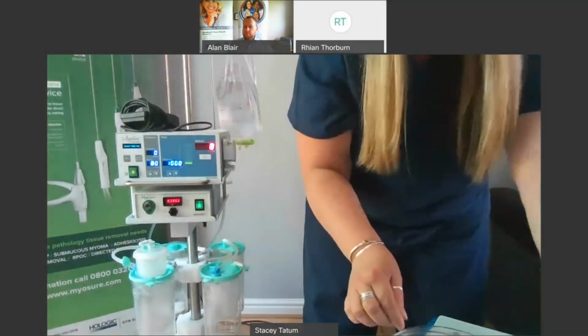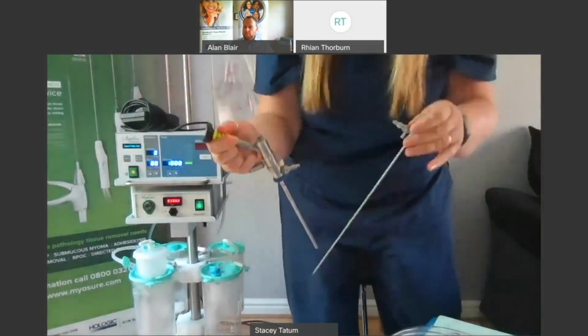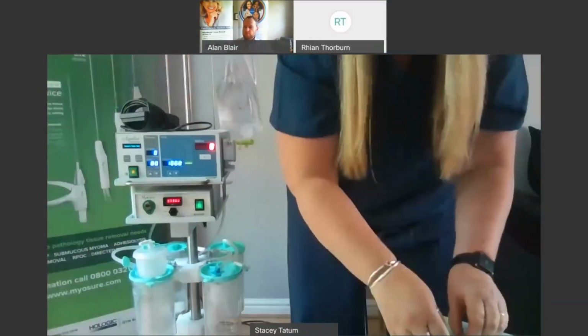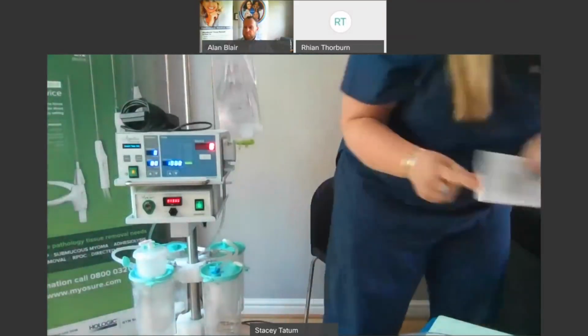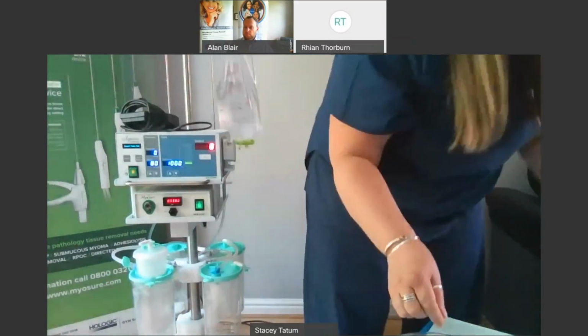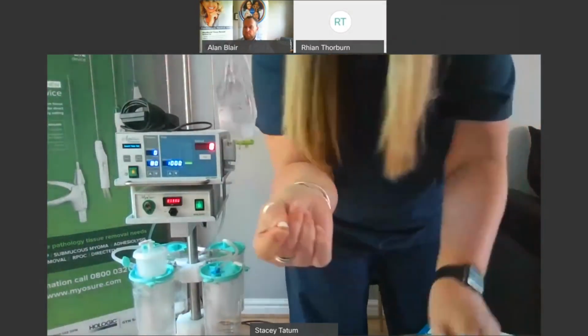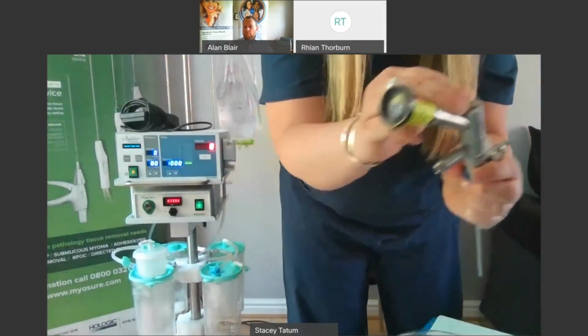So when you get your scope out, it will come in two parts. You'll have the main body of the scope and the outflow channel, and in a little trinket box you will have a light lead adapter and some end caps. So you want to be opening up your scope seals. There are 2 in a packet. We want to be putting those into the scope. I've got one there. They're dome shaped, and it goes dome side in.